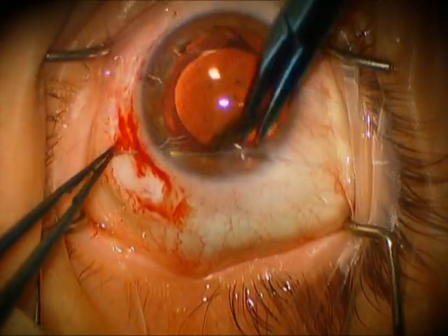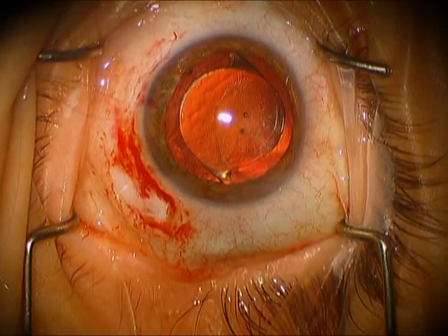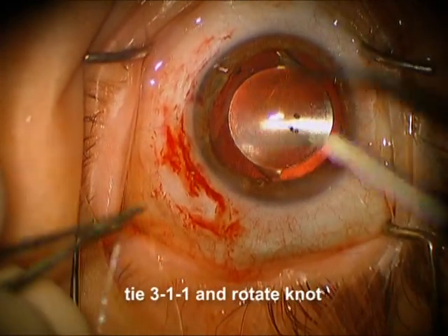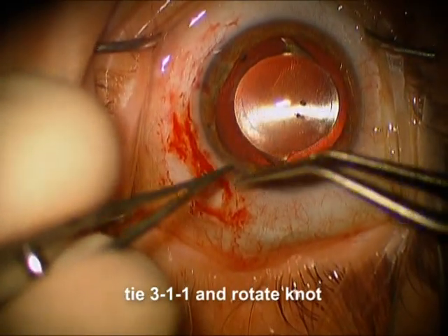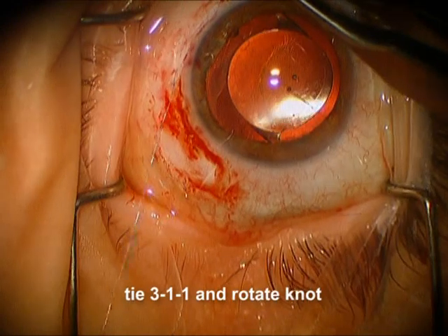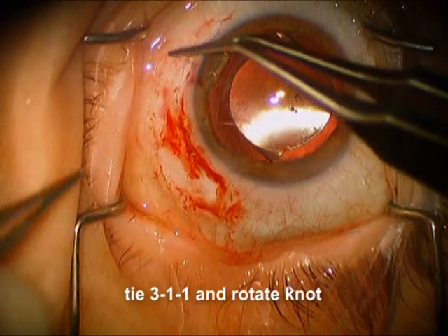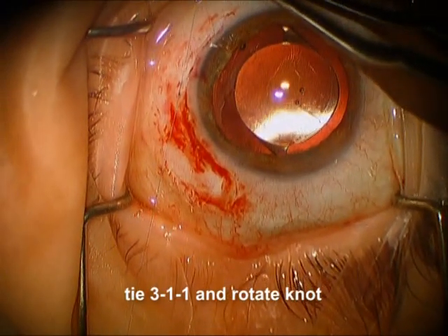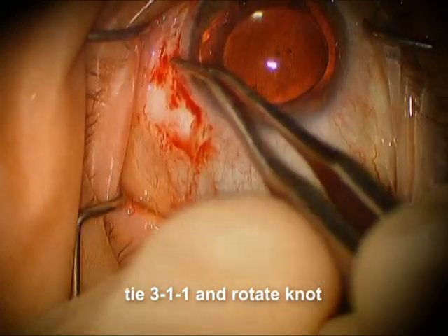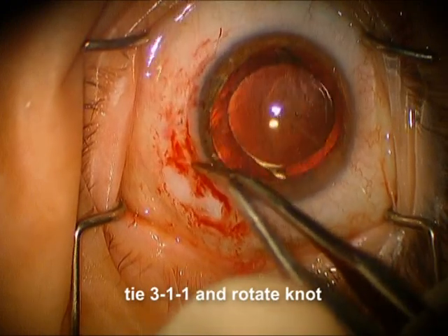So now we're going to place the other suture here. Don't tie it down until you've placed the other side — it's just much easier to pass these without having the other side tied down. Now we're going to go 3-1-1 with this 10-O prolene. Usually the 10-O prolene will nicely rotate. 10-O prolene is plenty good for iridodialysis repair. It's probably not good enough if you're going to suture a haptic because it tends to break when suturing something under tension like a haptic. So now we're rotating that knot so that it is buried inside the eye, and doing that on both sides.